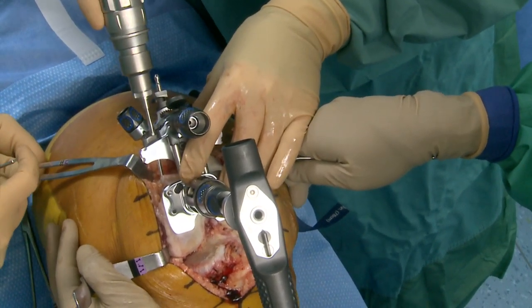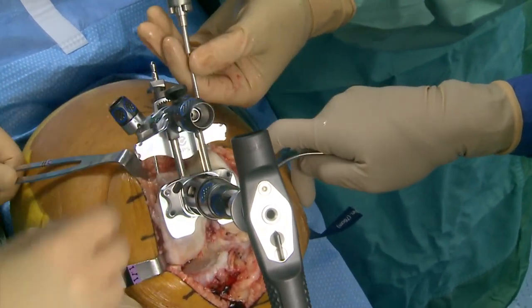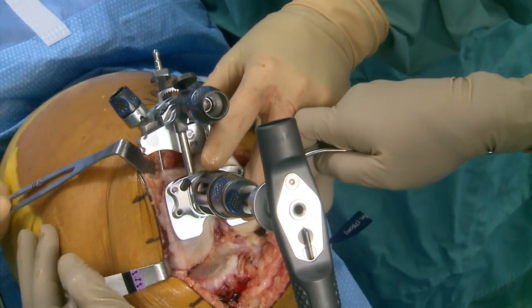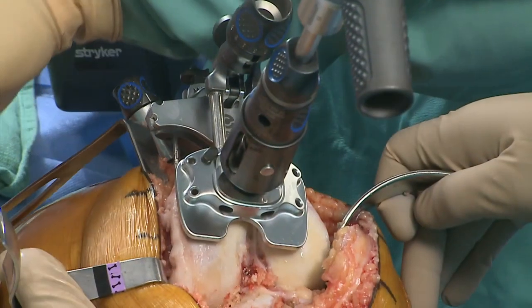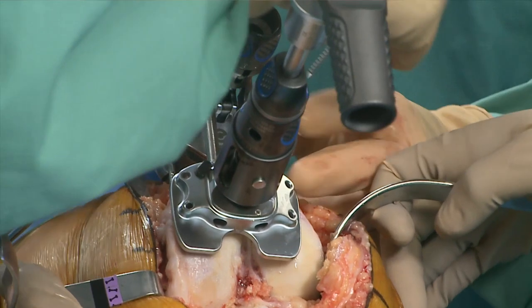This is going to be the tracker. We're drilling some smooth pins in first, but this has to be extremely stable to the bone, so we'll put some threaded headed pins in as well, which fixes it a little more solid.